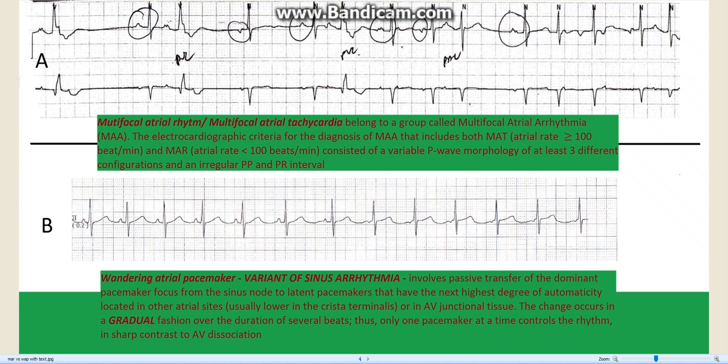Strip A is an irregular rhythm with variable P wave shapes or morphology, irregular PP and RR interval, and variable PR interval.